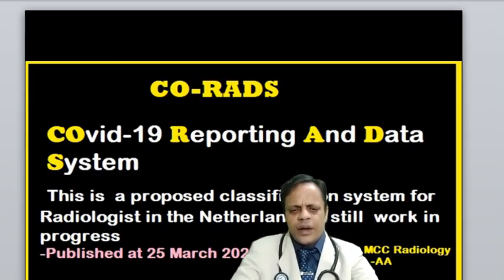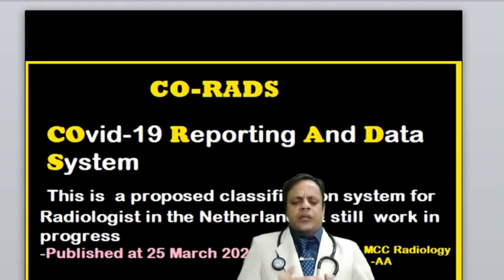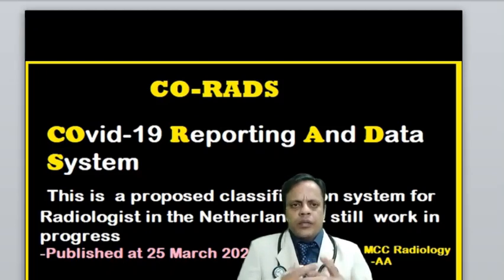Okay, let us discuss a little bit about CO-RADS. CO-RADS is the COVID-19 Reporting and Data System. Like if you know mammography, sonomammography, we give a BI-RADS classification, similarly this is the radiology CO-RADS classification.